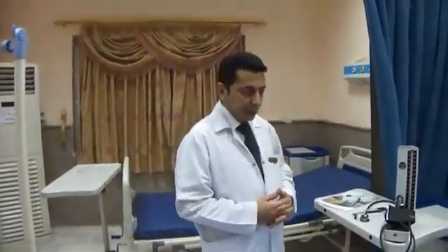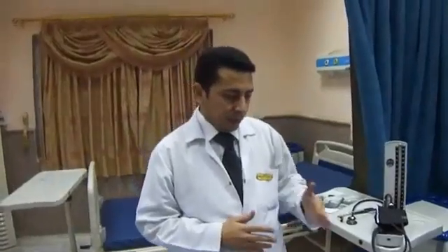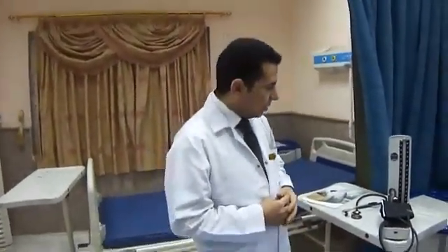Today we will show the examination of the vital signs. The vital signs examination consists of blood pressure measurements, radial pulse assessment, respiratory rate assessment, temperature, and lastly pulse oximetry. We will show these measurements in sequence.